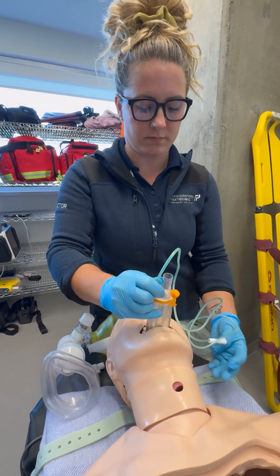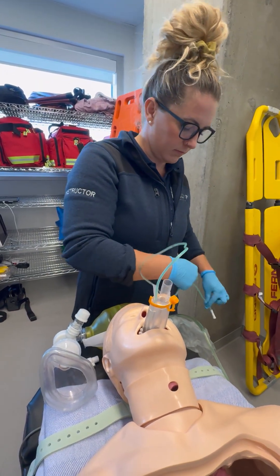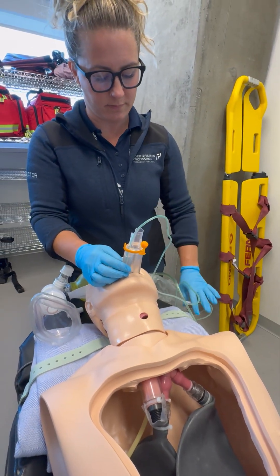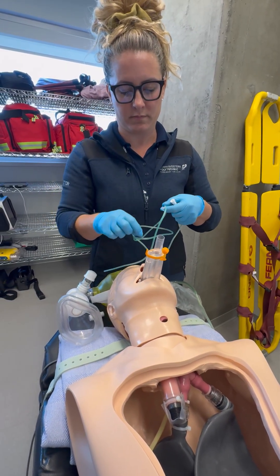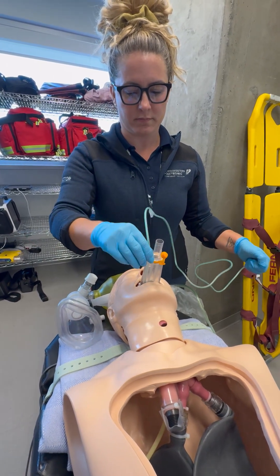Then you will attach the suction catheter to the suction tubing using the connector. Apply suction and observe for presence of fluids. Once fluid is cleared or 15 seconds has been reached, turn the suction unit off. You can then choose to remove the suction catheter or leave it in place.